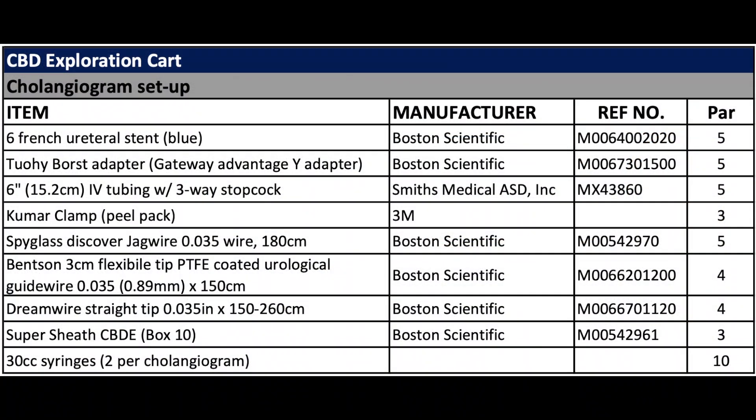Most of these items are available in the OR and anesthesia supply rooms. The wires, ureteral stents, and Tuohy Borst adapter systems specifically — those should be located in the urology section of central supply.